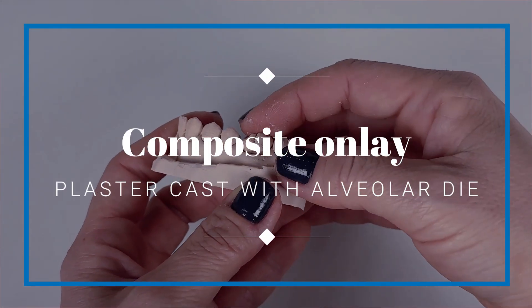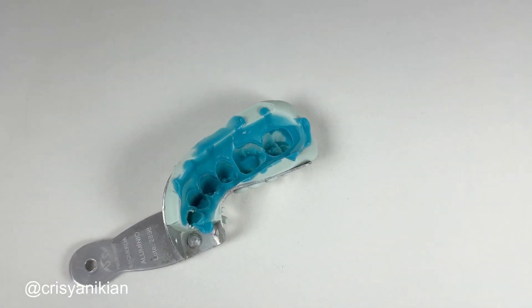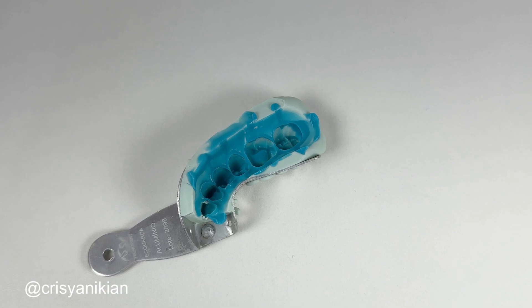How to make a plaster cast with an alveolar die. First, check if the mold was well made — the teeth need to be accurately copied.